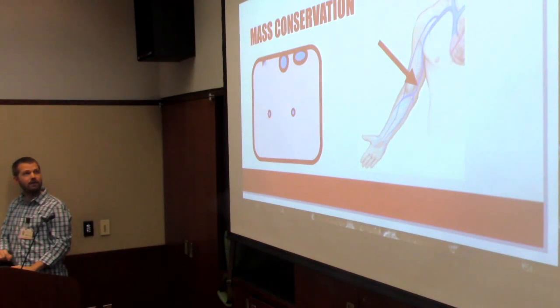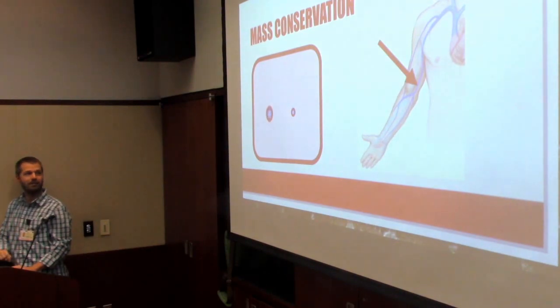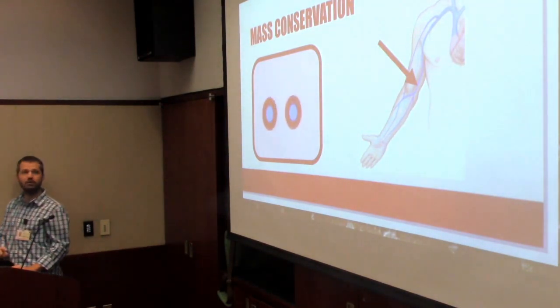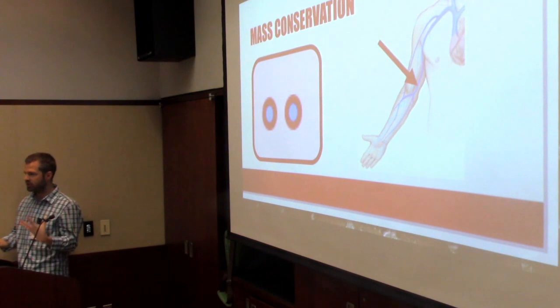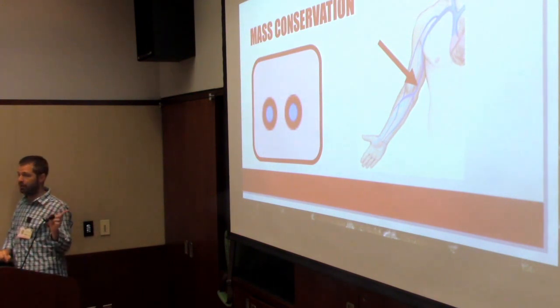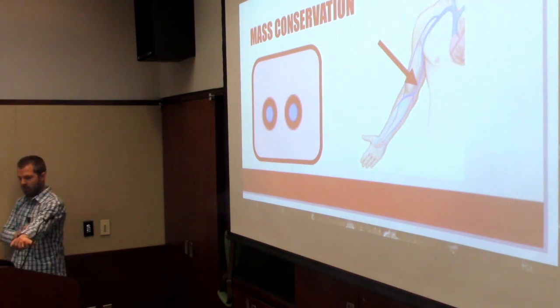So nurse A tries, kills that guy. Nurse B tries, kills that guy. Your attending wants to show off, kills that guy. What's gonna happen? Over time, when this guy comes back to the ED a few months later, and you're putting in an ultrasound guided IV, these guys are gonna be much, much larger, because that blood has to go somewhere. Unless their arm is massively edematous and blue, and there's vascular changes because the skin is all dying from vascular pressure, those other guys are probably being recruited. So people who have terrible access for a nurse to do by palpation have phenomenal vascular access deeper in the body. And right here, it's all through fat.